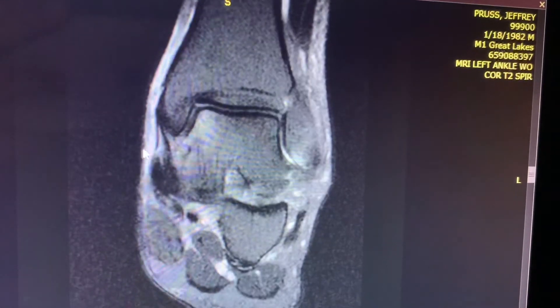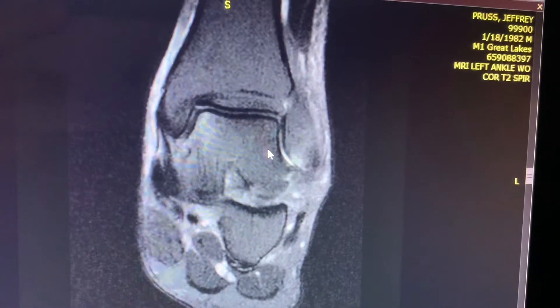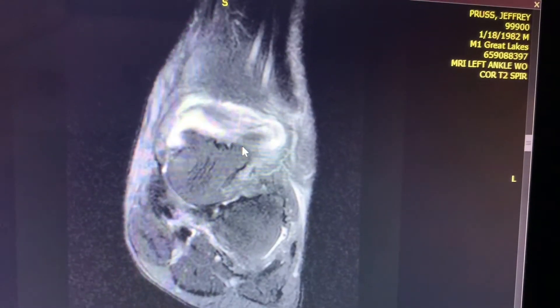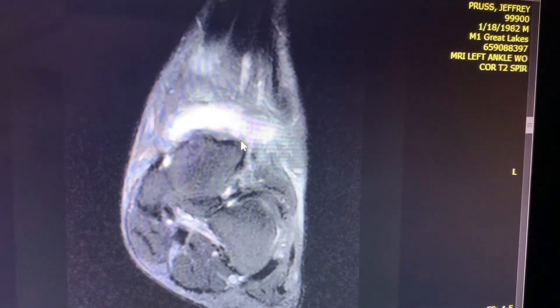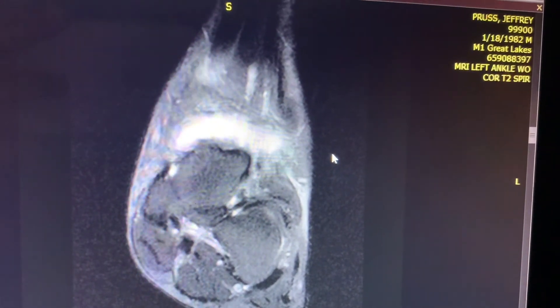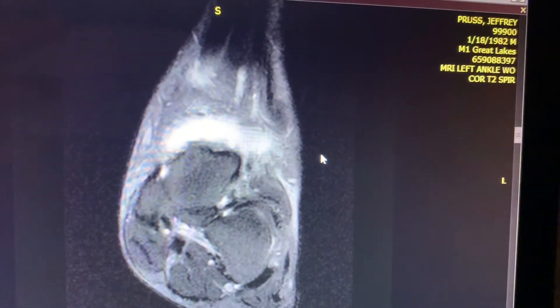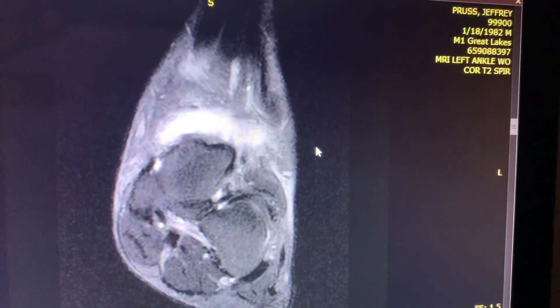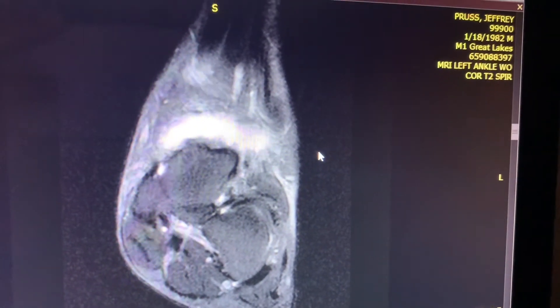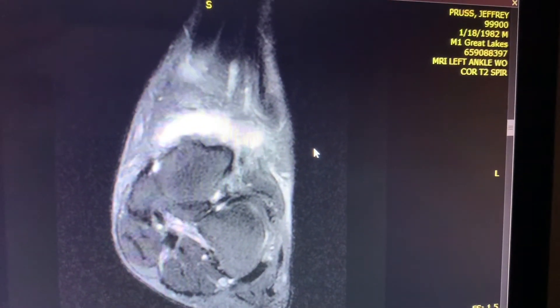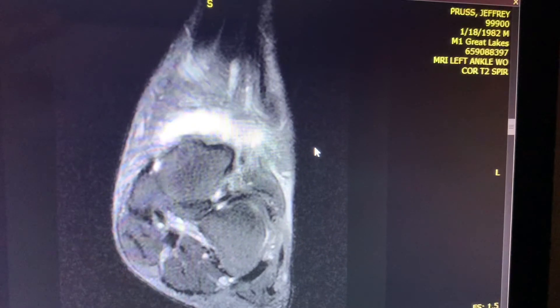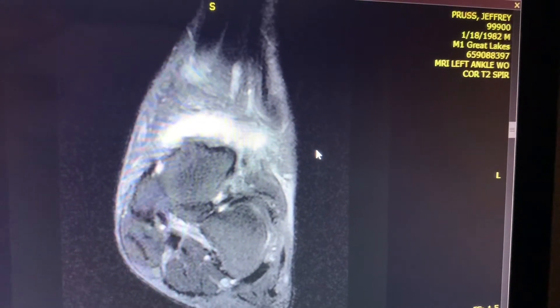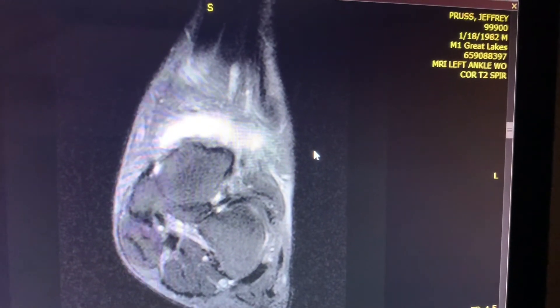This is an exceedingly rare case of an intraarticular synovial plica originating from two attachments — one on the lateral malleolus — and going all across the ankle joint, attaching onto the medial malleolus.